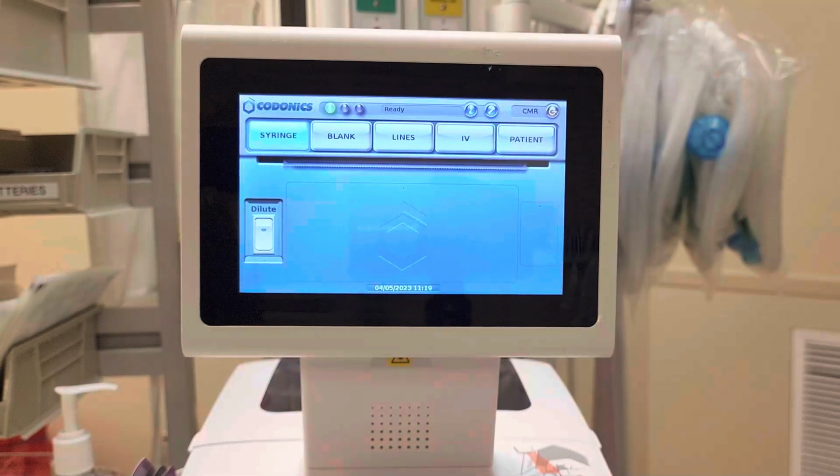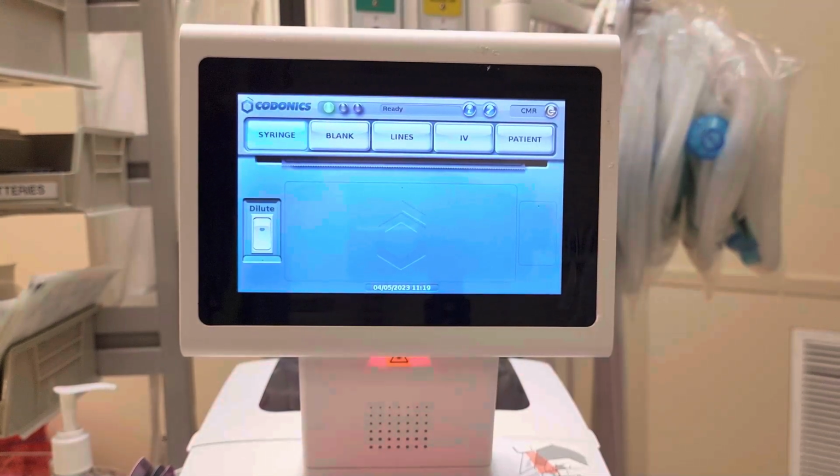We're going to be adding capability soon to do this with more drugs. If you have any suggestions, please let me know.